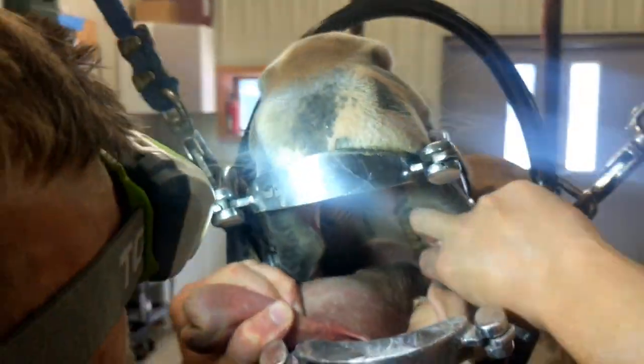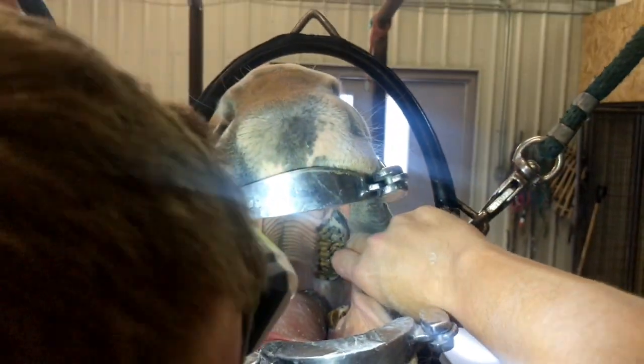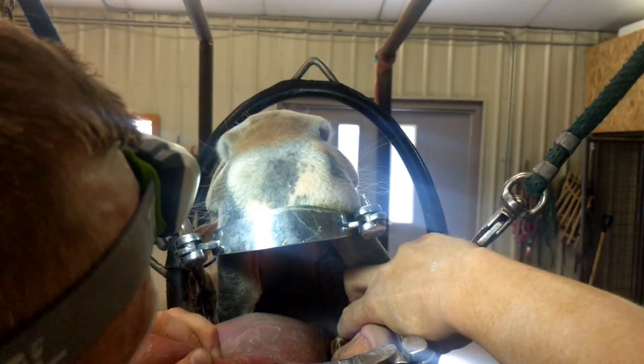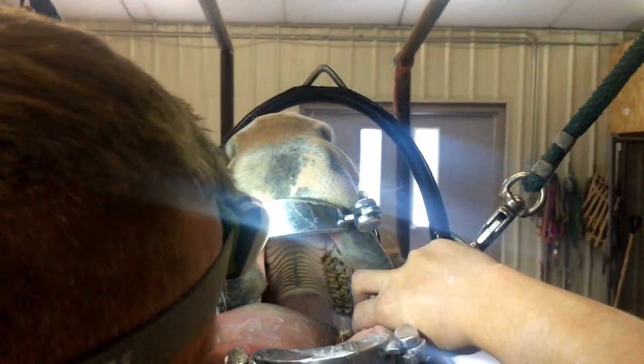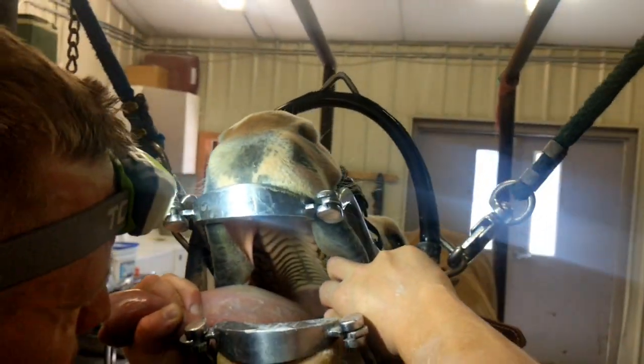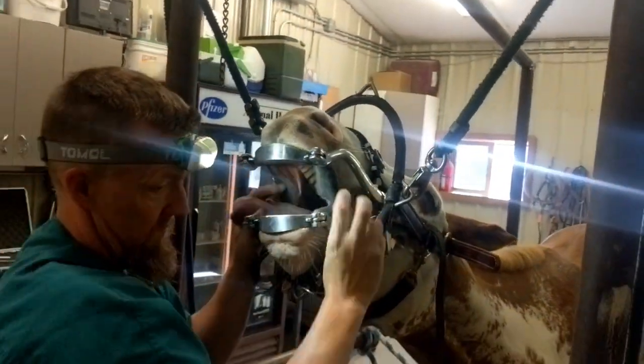What we did on this side — we took those down and beveled them away from the gums. Same thing down here, beveled it away from the gums.